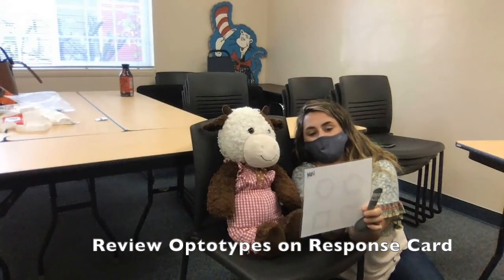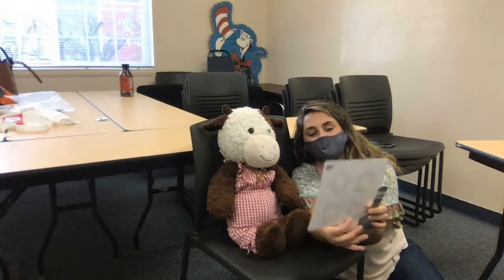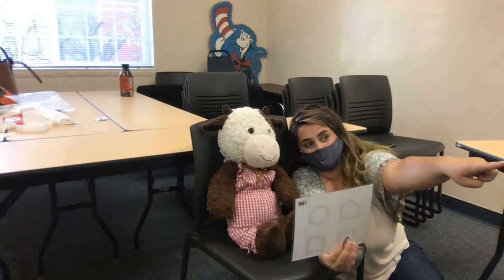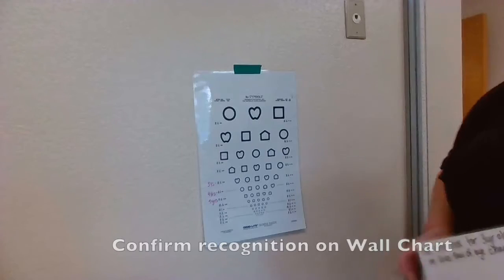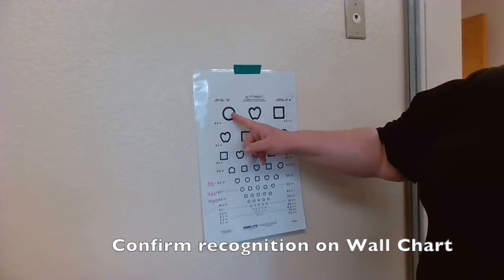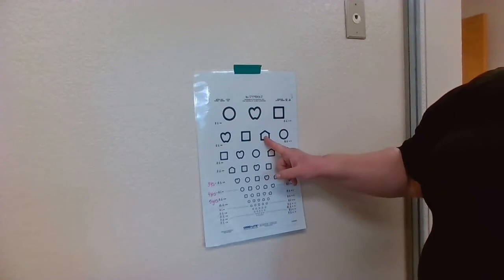You can see the staff members reviewing the optotypes or shapes on the response card to ensure the child is consistent with their responses. Confirm that the child recognizes the wall chart and sees the same optotypes or shapes.